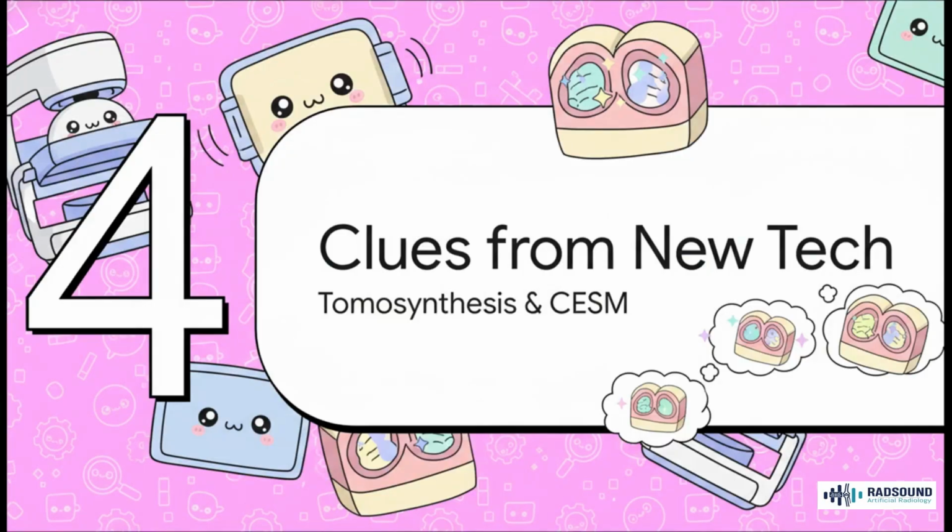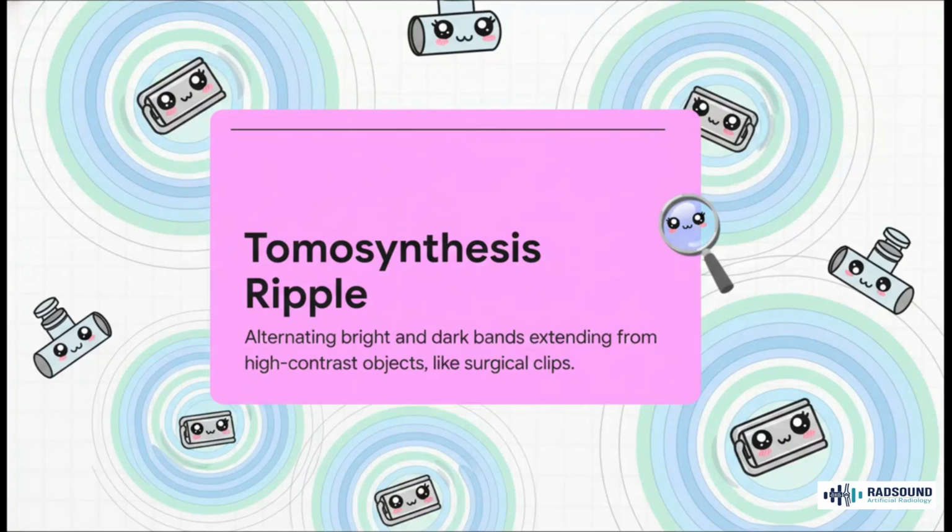And of course, as our imaging technology gets more and more advanced, the mysteries just get more complex. The kinds of artifacts a radiologist has to spot are evolving right along with the tech itself. New clues are popping up in 3D mammography or tomosynthesis, and in contrast-enhanced mammography. So, in 3D mammography, you can get this really specific ripple artifact. It looks like waves spreading out from something super dense, like a little surgical clip. The absolute key to identifying this false clue is knowing which direction it's going.